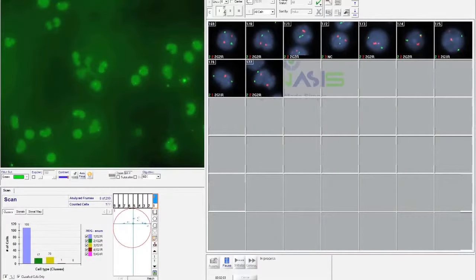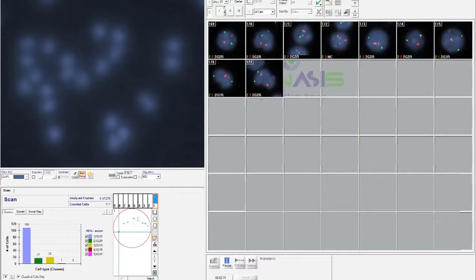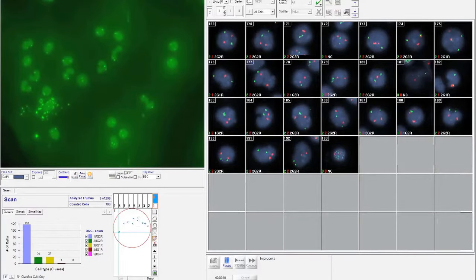The images are captured over all focal planes and relevant filters, building a Z-stacked image that can be presented as a 2D composite with all signals in focus.